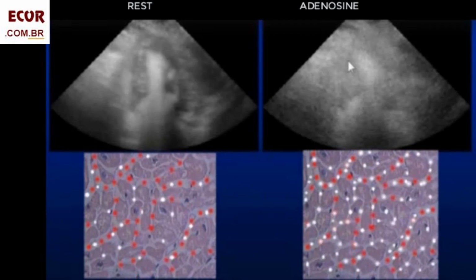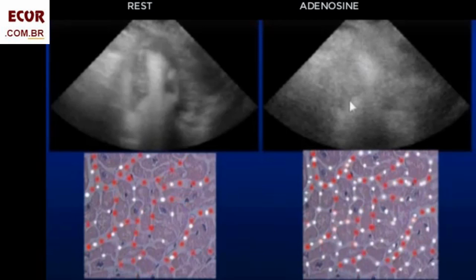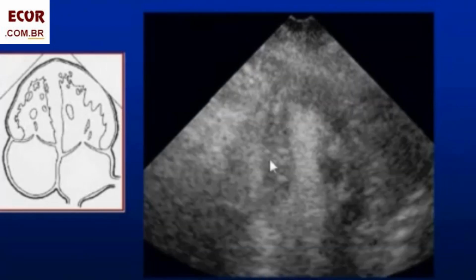When there is no ischemia and all regions have normal coronary reserve that responded with arteriolar dilation, there is an increase in blood flow in all microcirculation and hence more microbubbles in the capillaries of all walls with increased contrast. This is a normal perfusion with microbubbles using the IV Adenosine Bolus protocol.